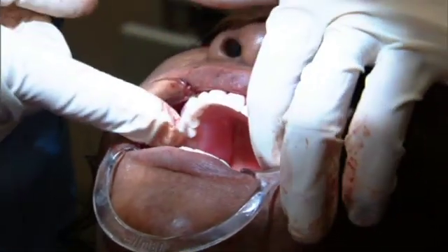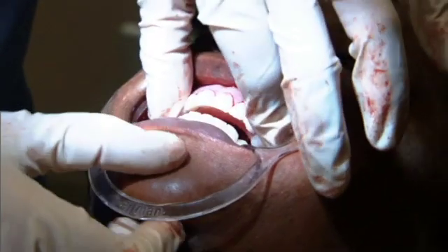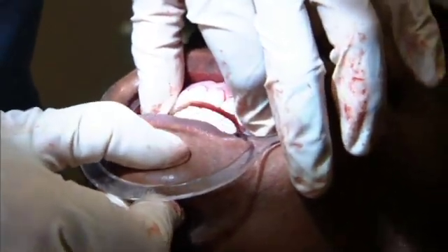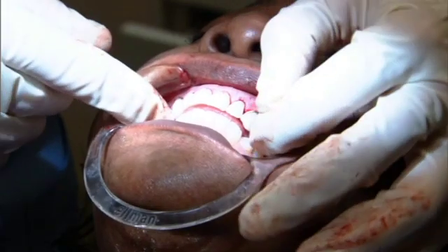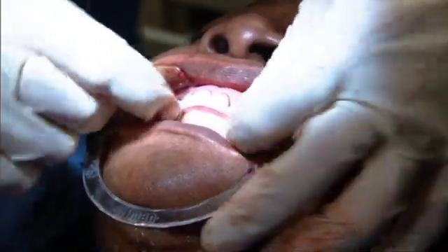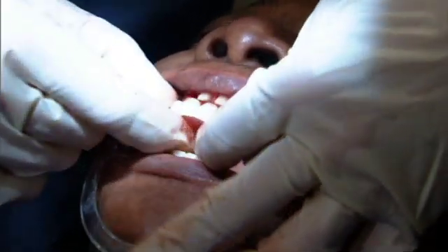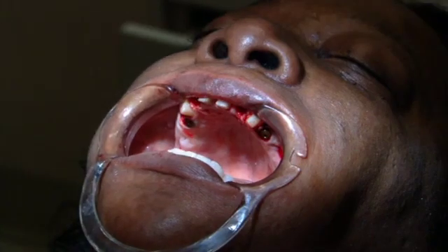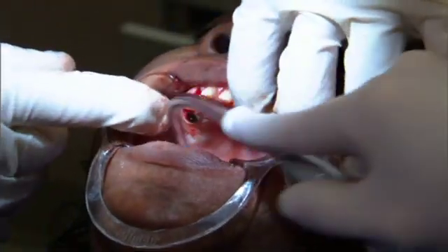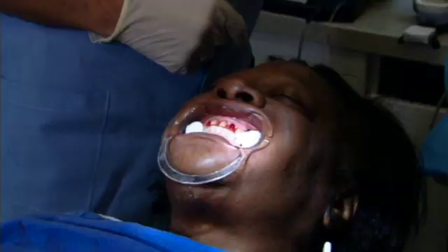Man, that's lovely. Bite together for me now, please, ma'am. Open just a little bit. Let's let your jaw just relax for a minute. And close. Good. We're sitting kind of on top of those implants, so I'm going to go relieve that. Kathy, I'm going to let you set up to reline those provisionals. Okay, open again for me now.